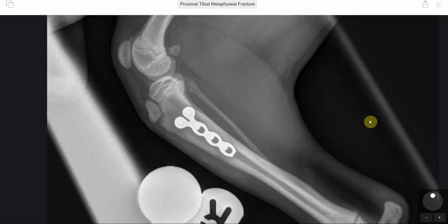At six weeks following surgery, you can see here that the fracture had healed fully. At the same time, the plate had not interfered with continued growth of the tibia, so we were pleased with that. The bone continued to grow beyond where the fracture was.